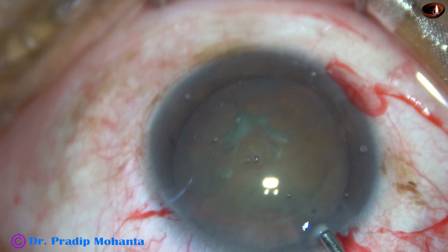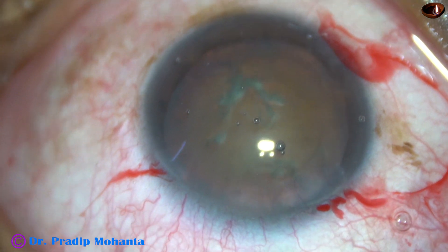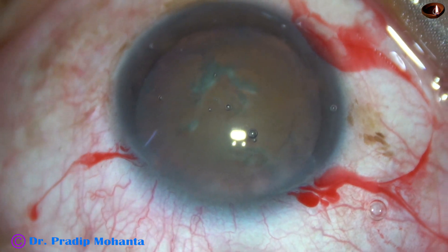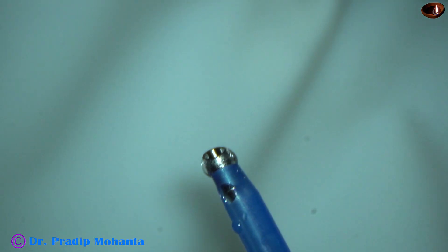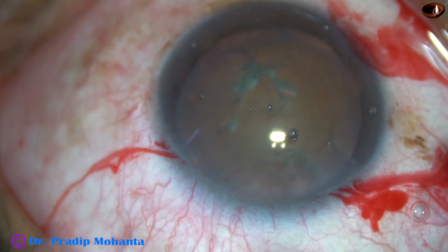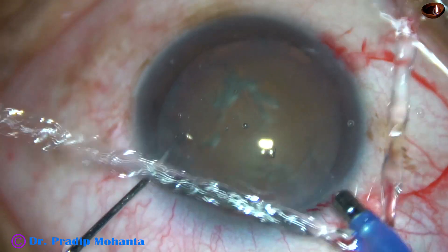Some more visco is injected into the anterior chamber and then the tip of the phaco needle is introduced into the anterior chamber. Now see the exposed part of the phaco needle. Since the cataract is on the harder side, nuclear sclerosis is about grade four, I have increased the exposed part.